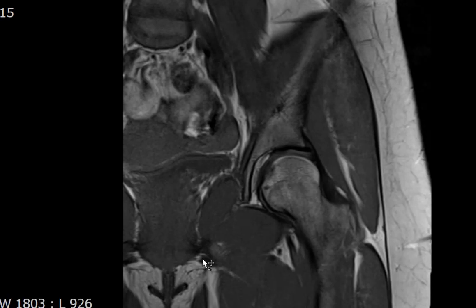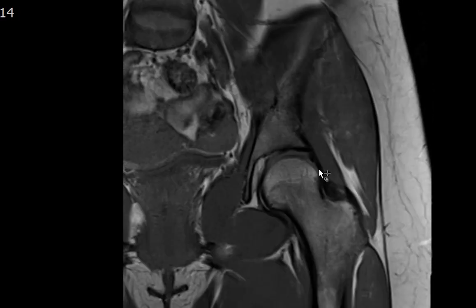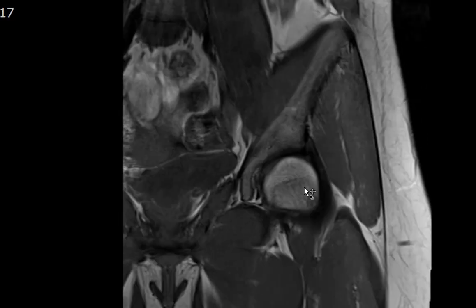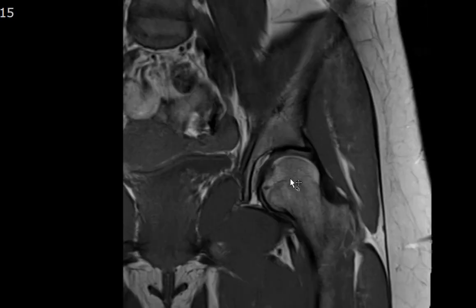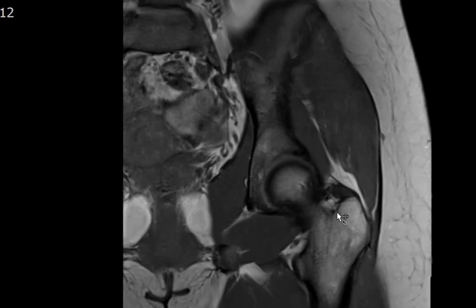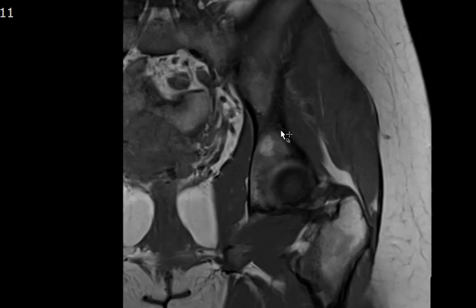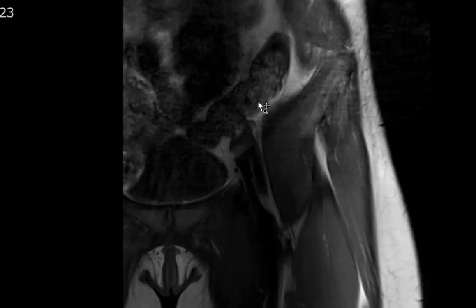I usually start with a coronal T1-weighted image of the hip, to look at the marrow and make sure there are no marrow contusions or fractures — no T1 hypointense line to suggest a fracture. The femoral head looks intact without any T1 hypointense signal. On T1, there should be no signal within the fatty marrow that is isointense or darker than the underlying muscle, which would suggest a marrow infiltrative process such as infection or tumor.